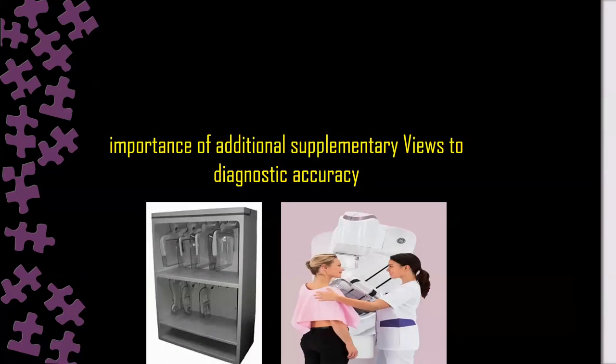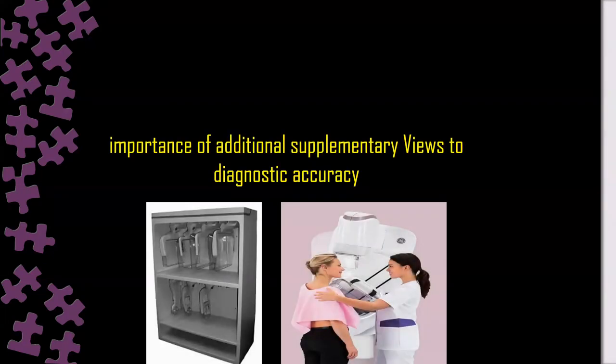Okay. So what is the importance, or what are the importances, of additional or supplementary views to diagnostic accuracy? Why are you doing supplementary views? The margins, to show more of the margins of the lesion, and whether the lesion gets more dense or less dense when we compress it, and the characterization of calcification for suspicious features. Yes, what else? Some lesions could not be shown well, for example, seen in one view and not seen in the other view.